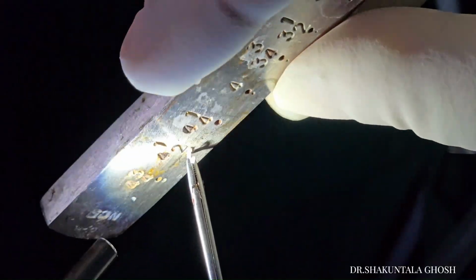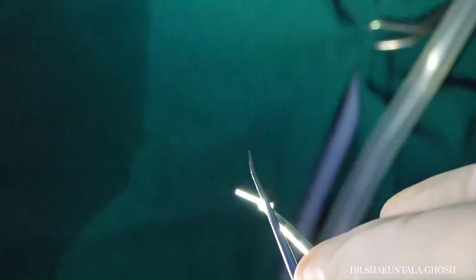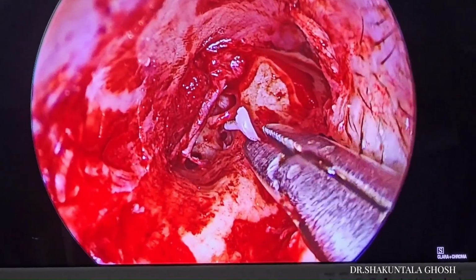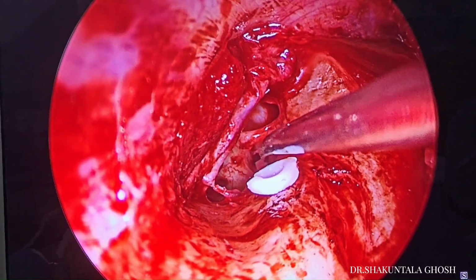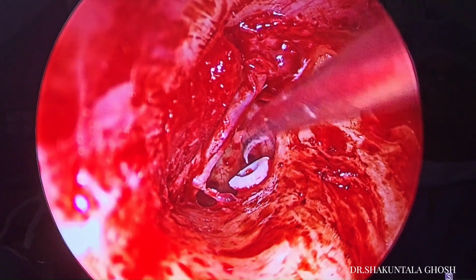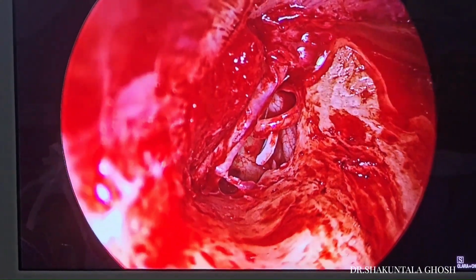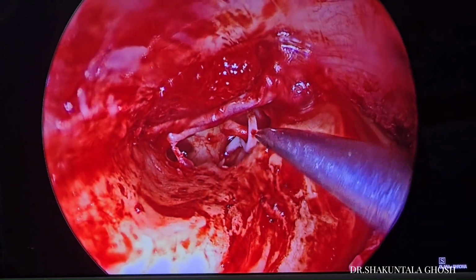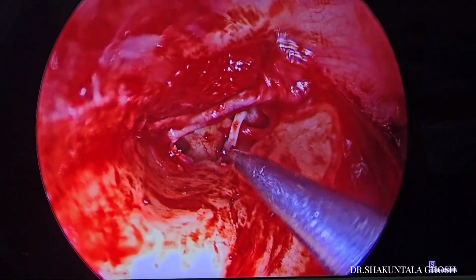And next, after having selected the Teflon piston, which is about 0.5 mm diameter and 4.5 mm long, I have opened the mouth of the piston and gently with the crocodile forceps I am introducing it, and with the help of the curved pick I am guiding it down into the fenestrum. As you can see, the medial end goes into the fenestrum, and then the upper part, the distal part, is hooked around the incus long process. Very easily it goes in.